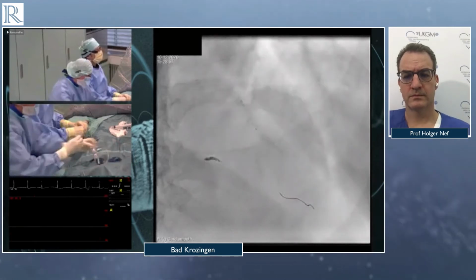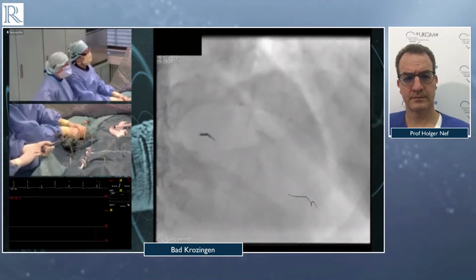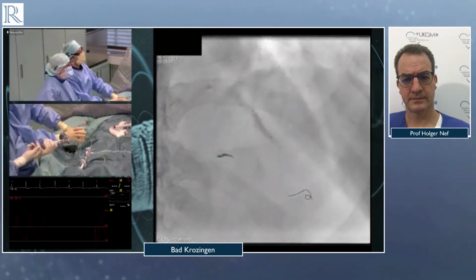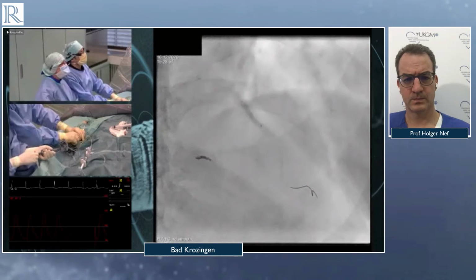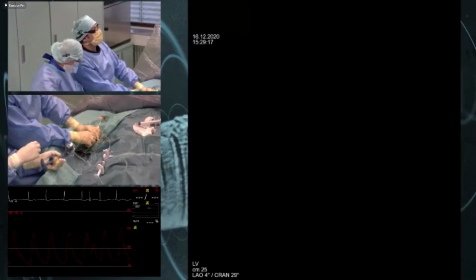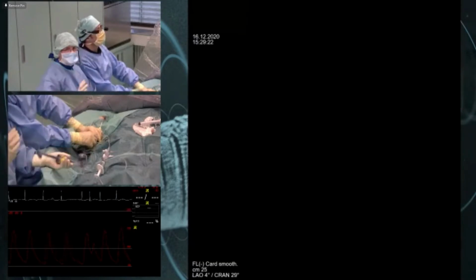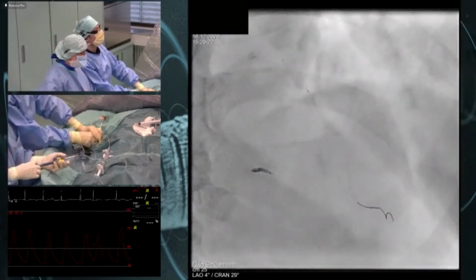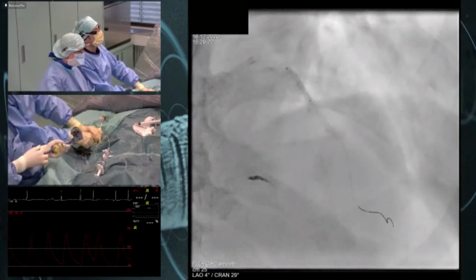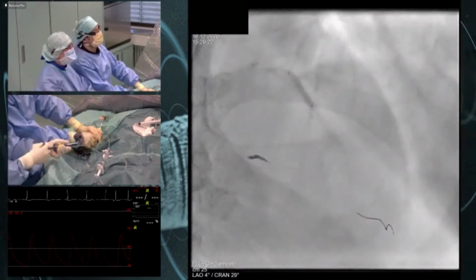Holger, if you implant. I think it's a good way, what Marek is telling, but sometimes if it's only one lesion, and you definitely have seen that you cracked it, I think you can also go directly with the stent. But here it's diffuse, calcified, and I think therefore it really makes sense to make a predilatation as well. What you can see now, it's a 3.0 balloon with 16 atmospheres, now even less, 12. Okay. And the balloon is nicely open.